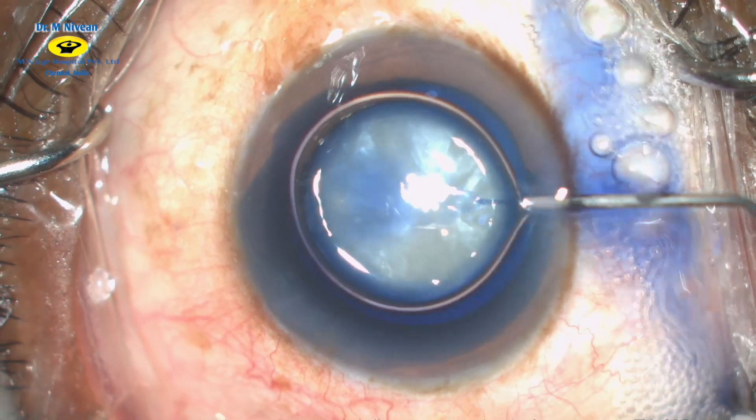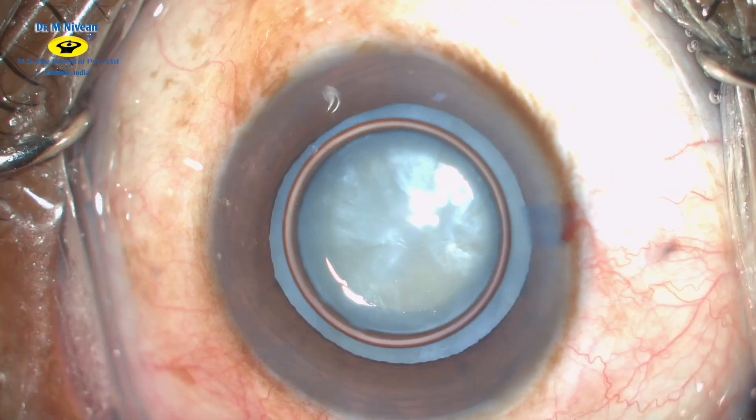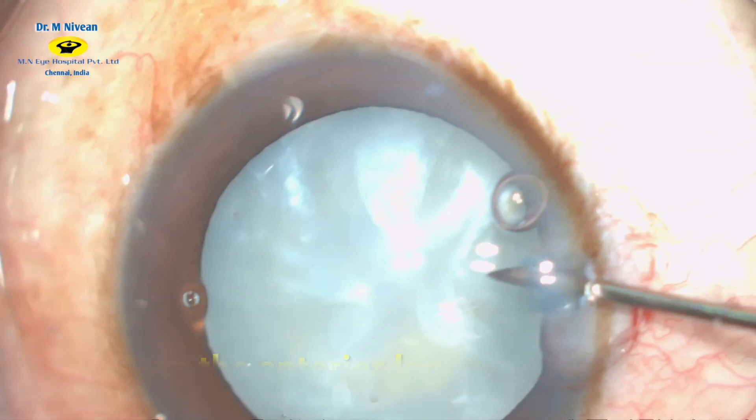Under an air bubble, trypan blue is injected to stain the anterior capsule. Viscoelastics are then injected to ensure a good fill of the anterior chamber.